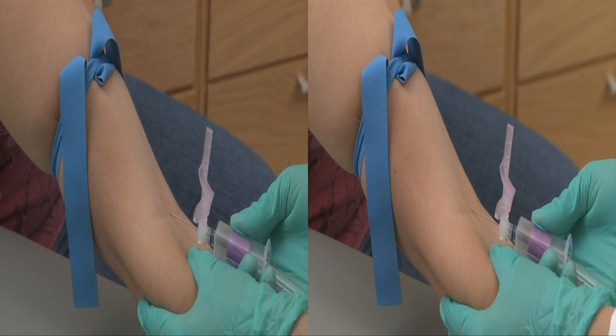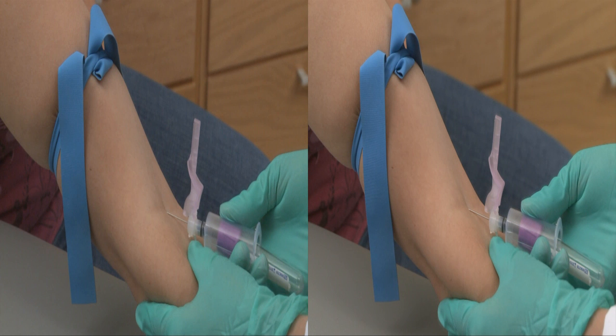Position the needle, bevel side up, and line it up with the vein. Position the needle so that it forms a 30-degree angle with the surface of the arm. With a single, short, but firm motion, swiftly insert the needle through the skin and into the vein.